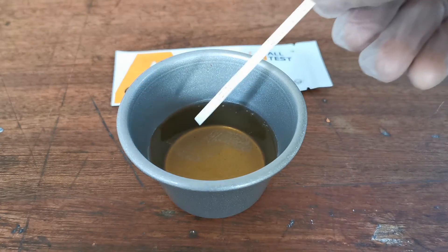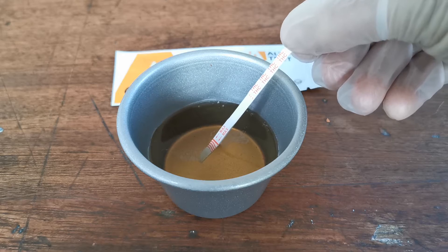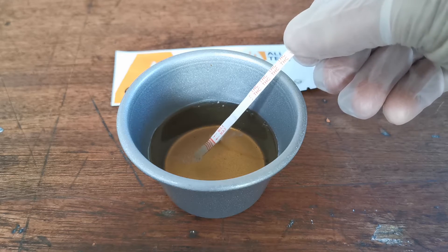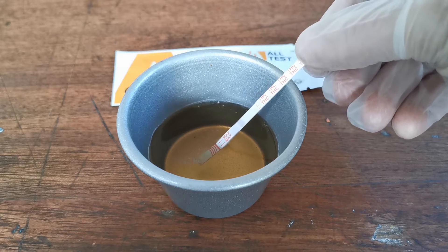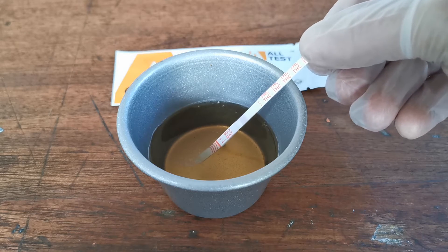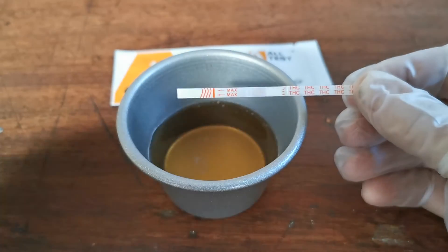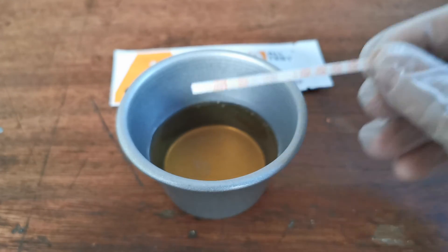Holding the handle end of the dip test, just dip it to just below the maximum dip level as indicated by the max and arrows on the dip end of the test strip, and you'll start to see in the central portion the dye starting to run in this lateral flow test.